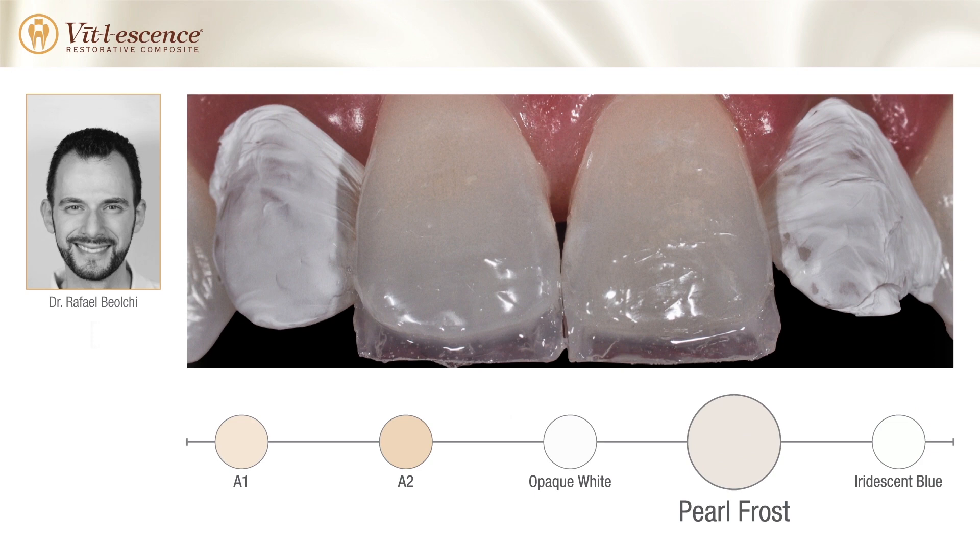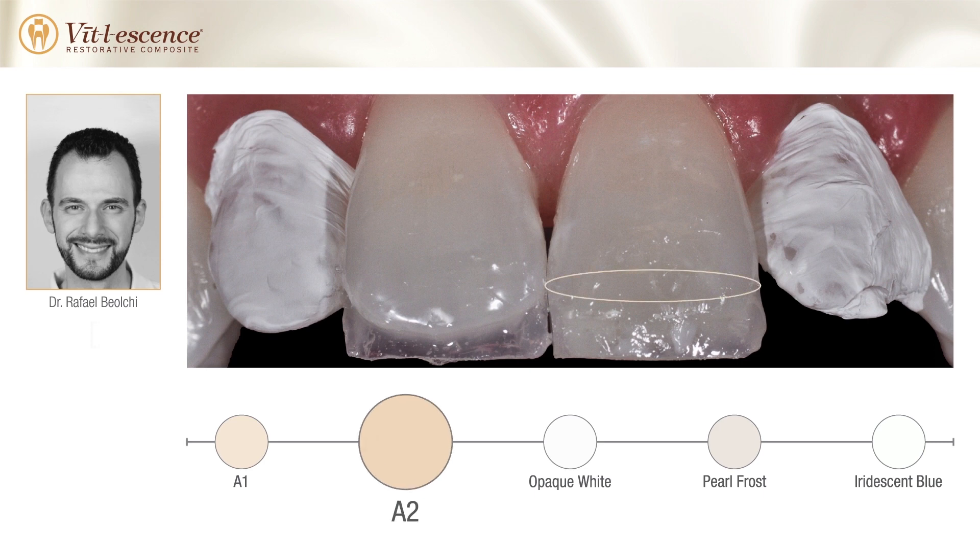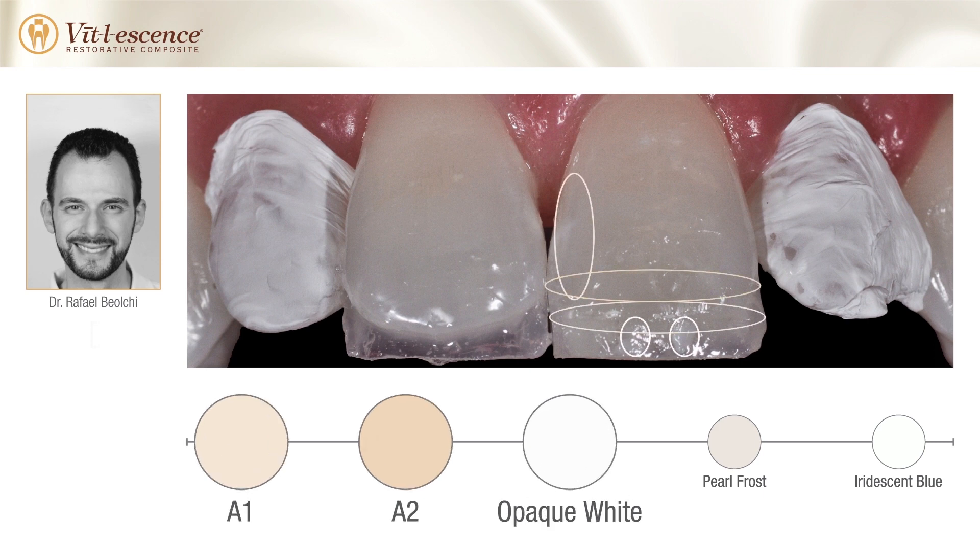Vital Essence Pearl Frost was used to form the palatal wall. Application of dentin shades A2 and A1 were placed, followed by an opaque white shade to reproduce the opaque areas of the incisal edge.